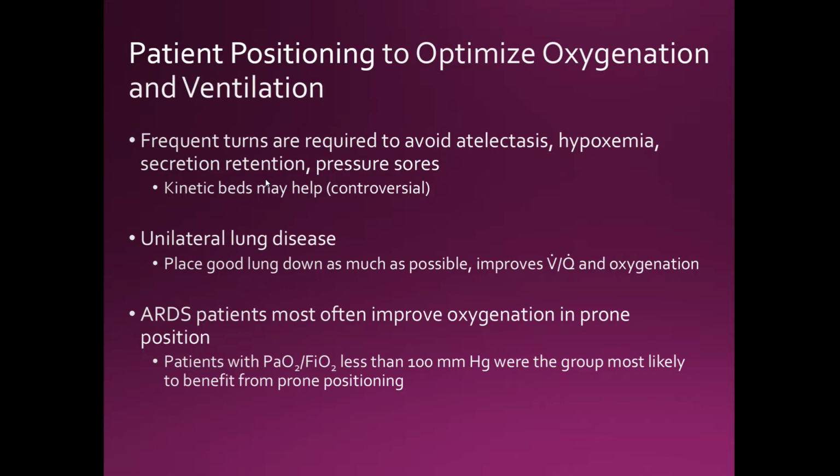Okay. Kinetic beds, I haven't seen one, but I've seen some beds where it can turn patients automatically. I think that'd be great. But the problem is if the patient is either heavy set or they move around a lot, a little bit agitated, they might kind of hurt themselves. They might fight the turn of the bed. So hence it's kind of controversial. Kinetic beds, I'm not sure. There are some that go upside down, meaning to say it flips the patient prone, and you start seeing that with ARDS, which we'll talk about later on in the slide.